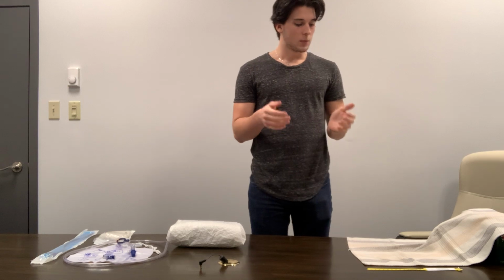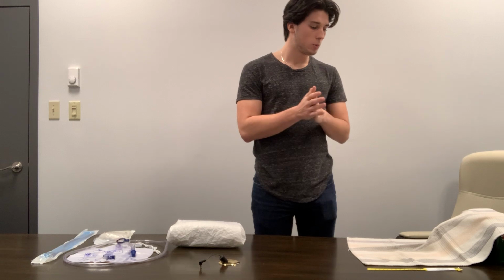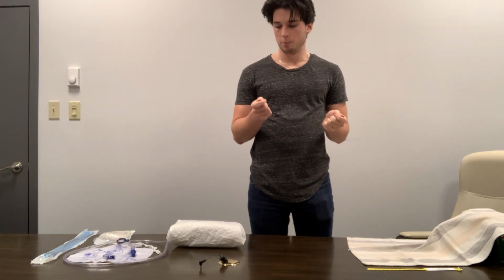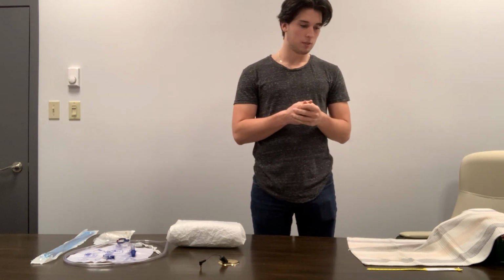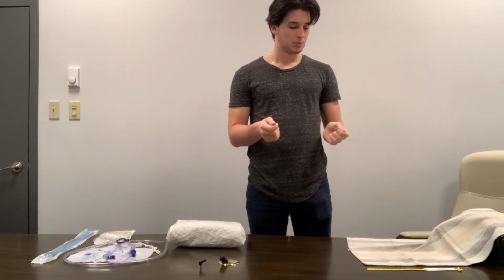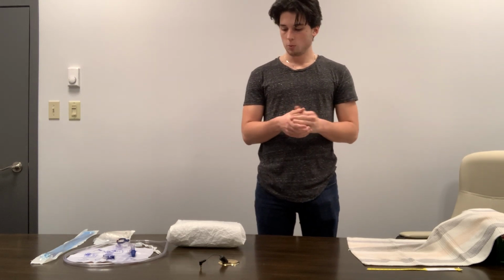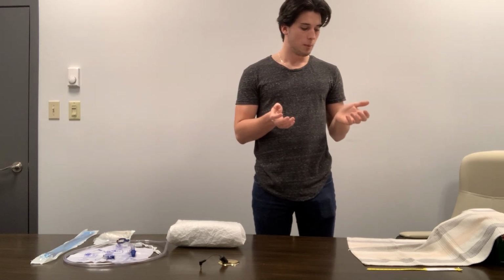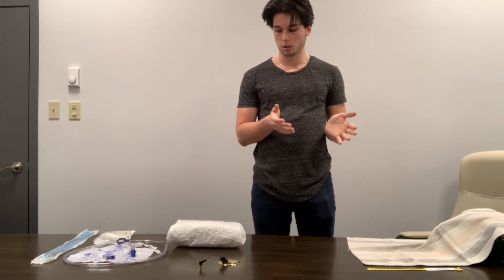So today, Jake, we're going to be inserting a Foley catheter, which is a sterile tube that will enter up your urethra into your bladder, as the physician requests that we monitor your output. So we will need to insert this Foley catheter. We will also be injecting 10 milliliters of sterile water into a balloon at the end of the catheter inside your bladder, just so that the catheter doesn't slide out and it's stable in place. So then once that is in, we are able to drain the urine into a bag where we can monitor it. So if that's okay, can we proceed with the procedure? And the patient's going to say, yes, you're okay to proceed with the procedure.